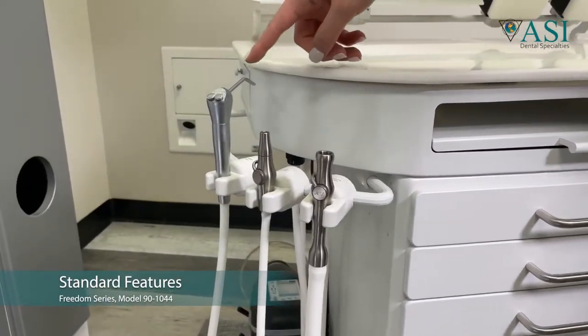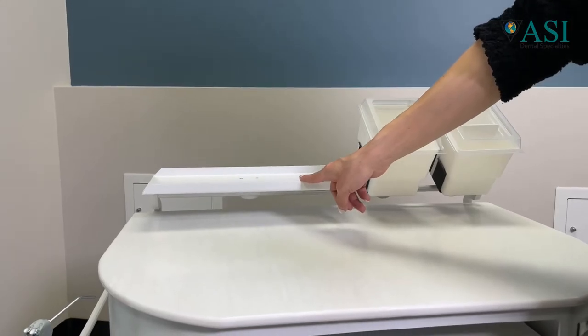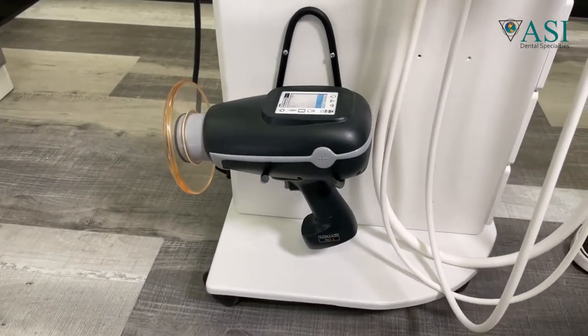Standard features include three titanium instruments made by ASI, two storage tubs, and a work shelf. Optional items include a portable x-ray mount that can be mounted on the side, or a larger trash can bin.